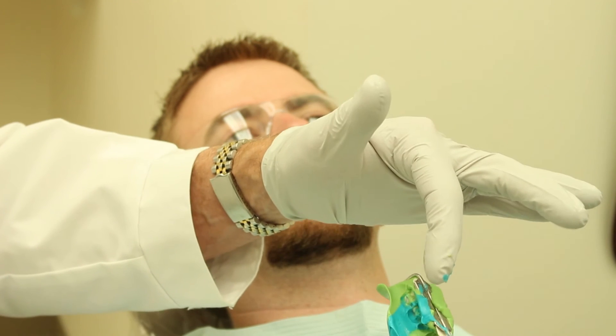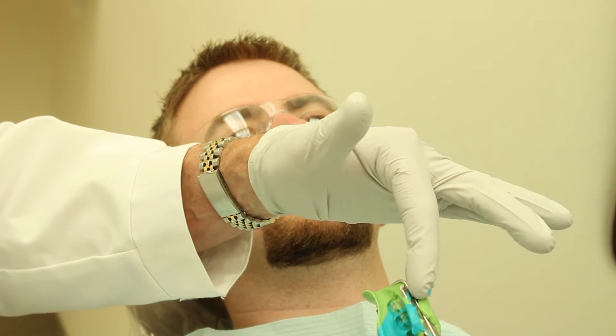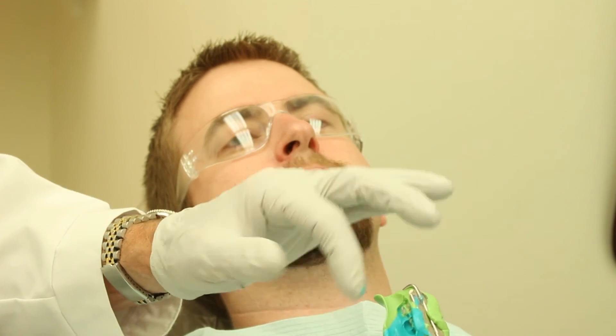Look at your tray and check for accuracy. If everything looks good, then it's ready to go to the lab.